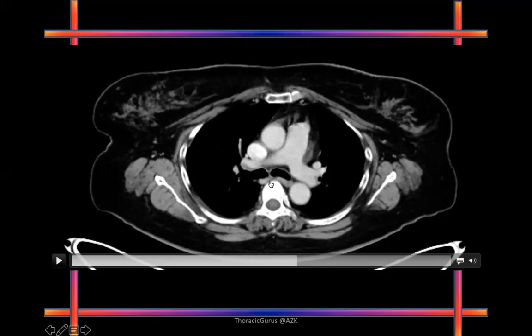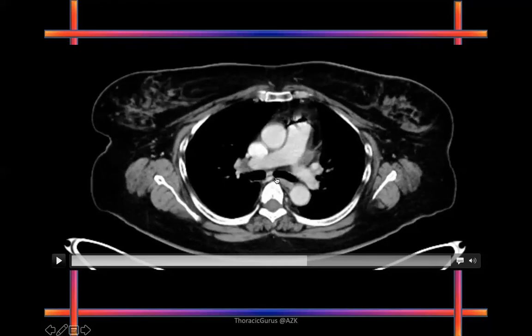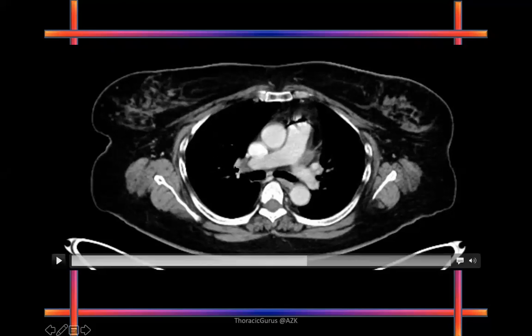What is this? It's the carina. Good. And what station is there? Subcarinal will be seven. Good. Easy? Not difficult? Okay. What will be the lymph node in this area? So that will be hilar, right? Number? Hilar will be 10. Good. So 10 and 10, right and left.